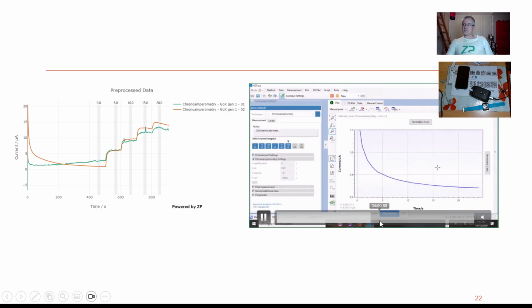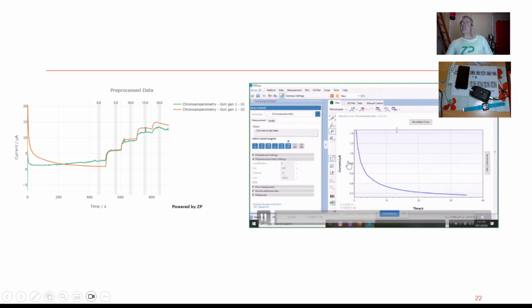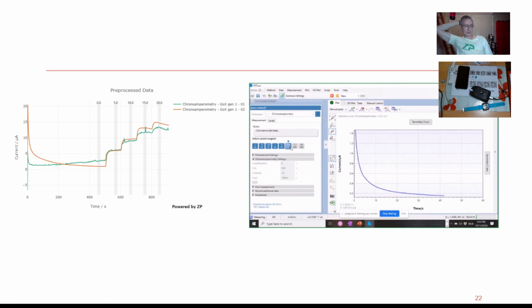First thing he's done here is he's using 650 millivolts, so similar to yours. He's just baselining himself here with 0 PBS. It's probably worth noting the kind of current that he's got. You had hundreds, if not maybe up to hundreds of microamps. Poor old Andre here, he's got like 0.2 microamps, 200 nanoamps. I could accept you would get hundreds of nanoamps, but the kind of currents you're getting, no, this is something else.